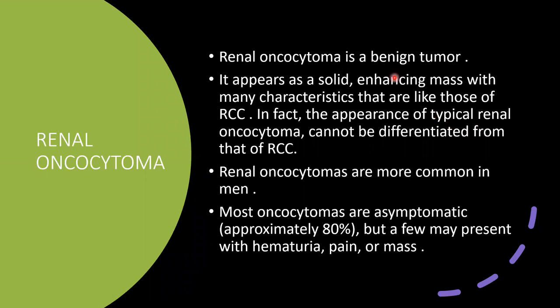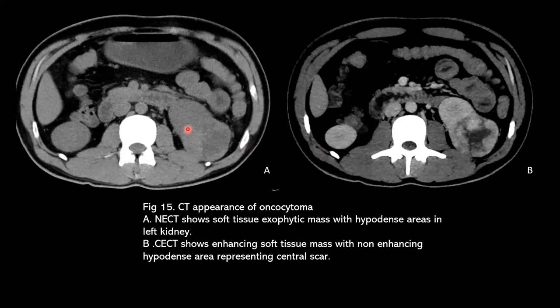Renal oncocytoma is a benign tumor. It appears as a solid enhancing mass with characteristics similar to RCC; in fact, typical renal oncocytoma cannot be differentiated from RCC on imaging. It is more common in men and is usually asymptomatic but may present with hematuria, pain, or a palpable mass. NECT shows a soft tissue exophytic mass with hypodense areas. CCT shows an enhancing mass with a non-enhancing hypodense area representing a central scar.